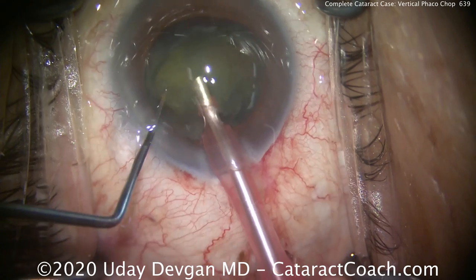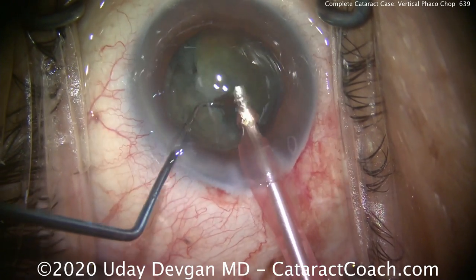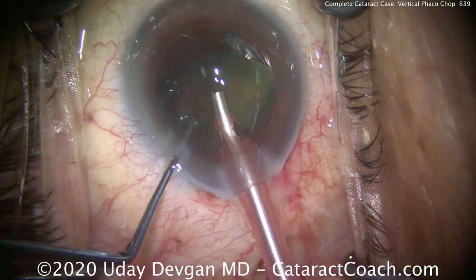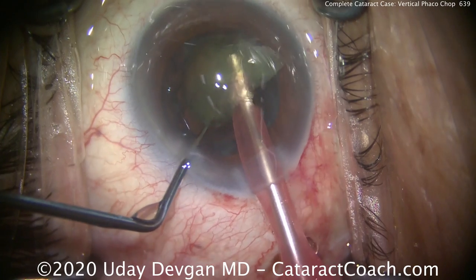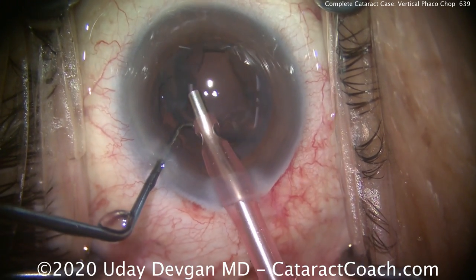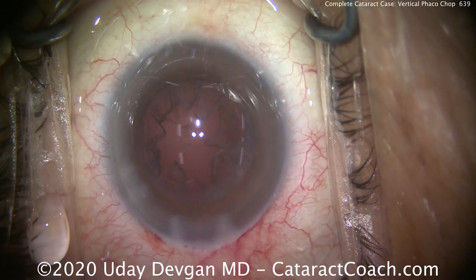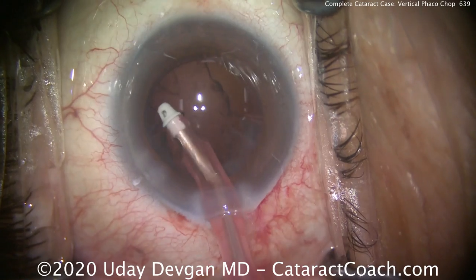Buzz in again. Look at the chopper placement now — we'll buzz into this piece and divide it up even more. This first nuclear half came out of the bag so easily; we're just emulsifying it. After that first initial vertical chop, we pretty much just need to emulsify that piece. We've got one half of the nucleus out, here's the other half, and there's more of a horizontal chop. The vertical chop we did was the beginning — to initially split the big nucleus into two hemi-pieces. Vertical chop means both the phacoprobe and the chopper are within the confines of the rhexis; you don't have to go around to the lens equator. You put the phacoprobe, aim it towards the optic nerve, dig in the chopper, aim it the same way, and just pull the two instruments apart. That propagates the chop from the anterior surface of the cataract to the posterior part of the cataract, and then you're fully separated and it's completely propagated.